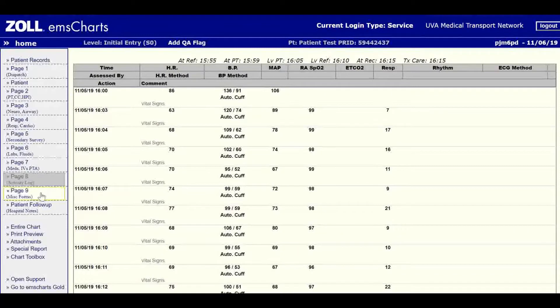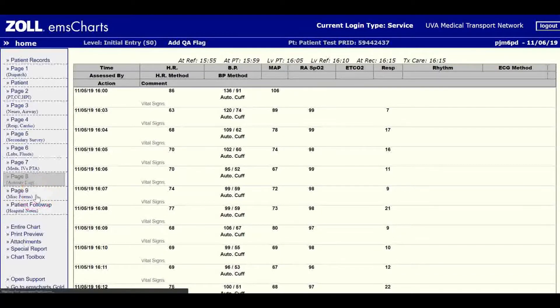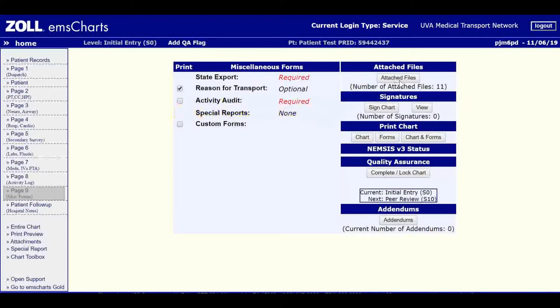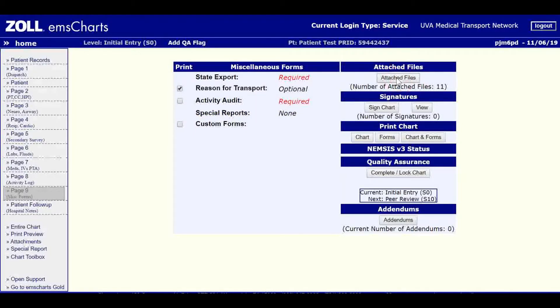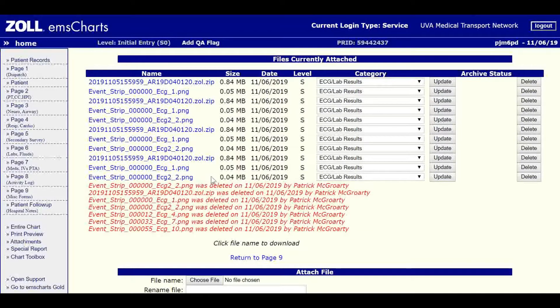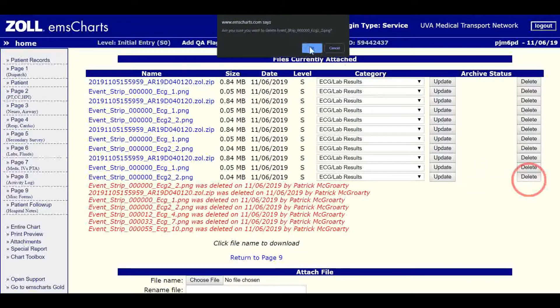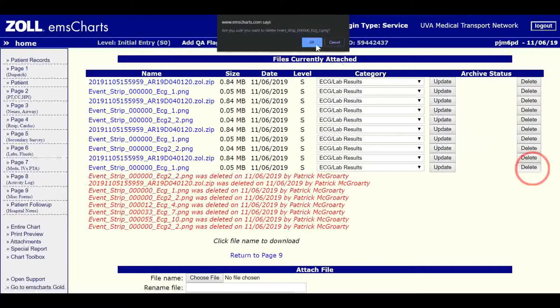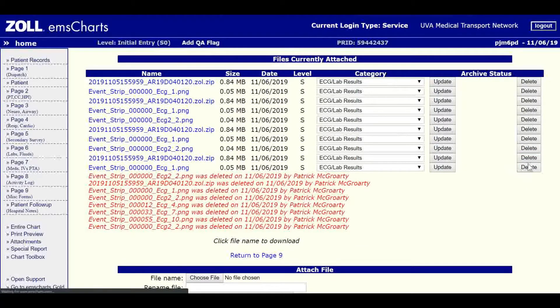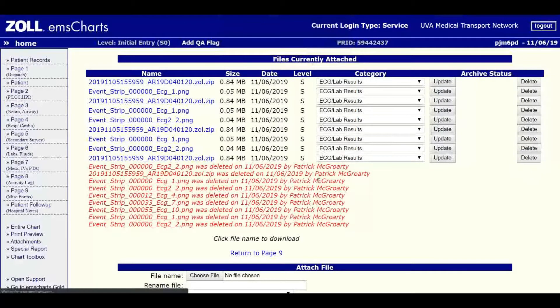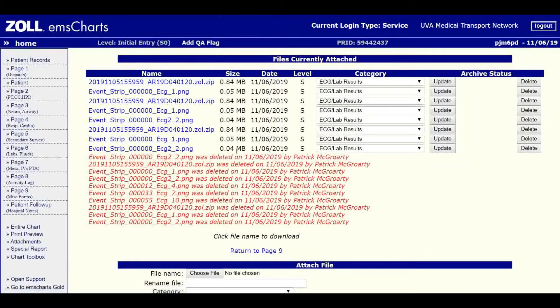Going to page 9 now, I want to show you something about those reports at the bottom. You'll see here that there's a number of files attached, and if we view them, we'll see the zip file that contains the entire case, which can be seen on the Zoll data viewer. You can then delete any files which you may have erroneously selected previously and don't want included in the case.